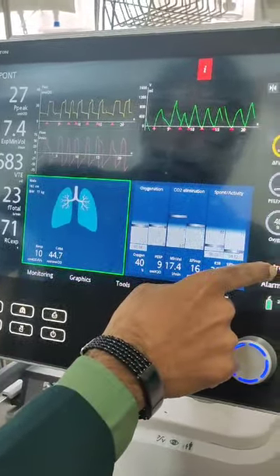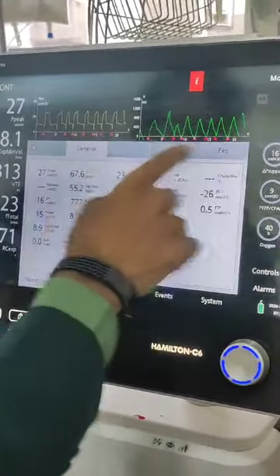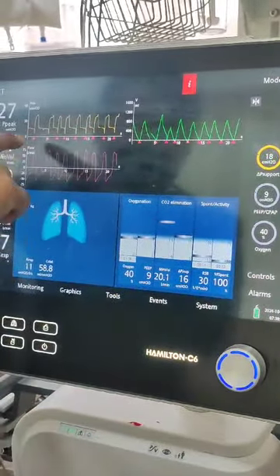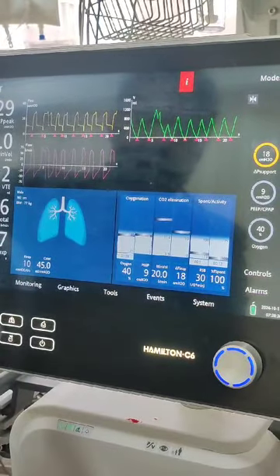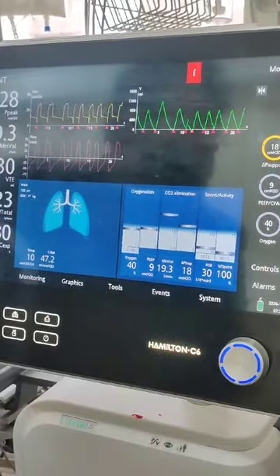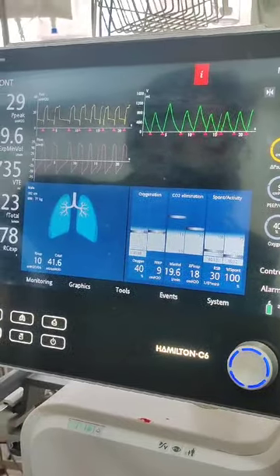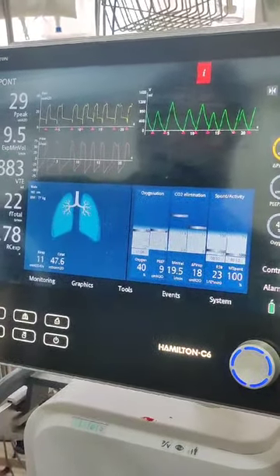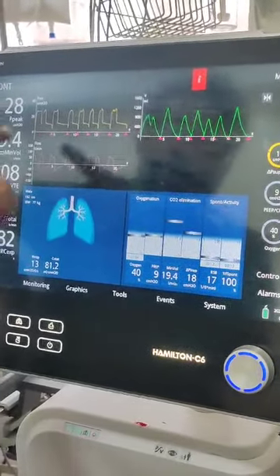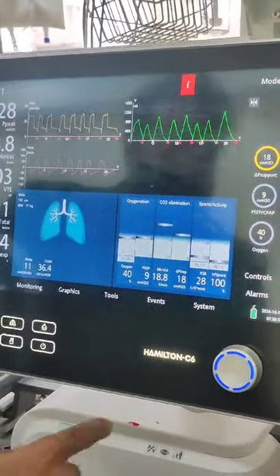Let's go back to P0.1 and see what is happening there. It's gone high — so that's not a good sign. He requires 18. Since he requires 18, we'll see the graph tracing out. That's how we use the airway occlusion pressure. It's ironed off now, and he requires a very high pressure support. This patient is not ready for a spontaneous breathing trial. And if at all I want to do SBT, it has to be at a pressure support of 18 — otherwise I will likely injure the lung. This is how I adjusted the pressure support based on the P0.1 and the respiratory drive.